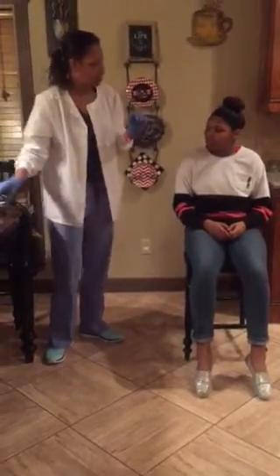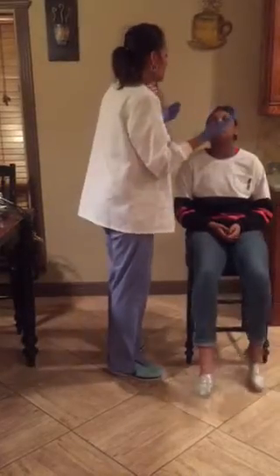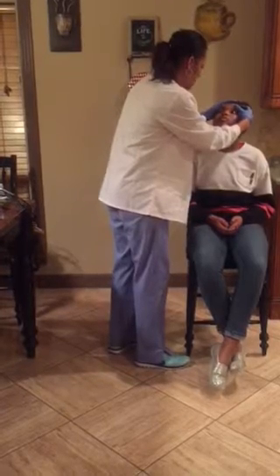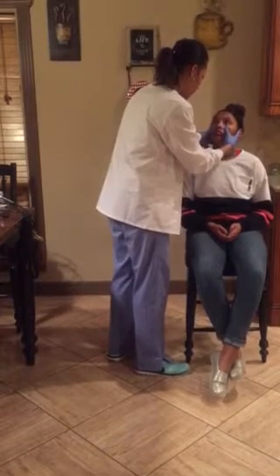I'm going to go ahead and check your nose while we're there. To do that, I'm going to put on some gloves, and I'm going to use an otoscope. That's basically going to check different areas of your nose. First of all, I want to just look at the sinus cavities to make sure that your sinuses are good. Kind of feel around a little bit.